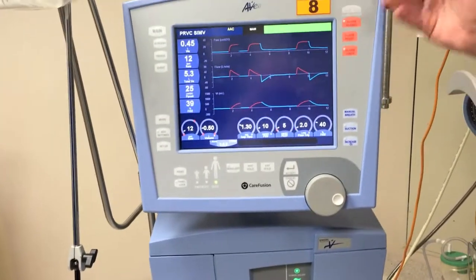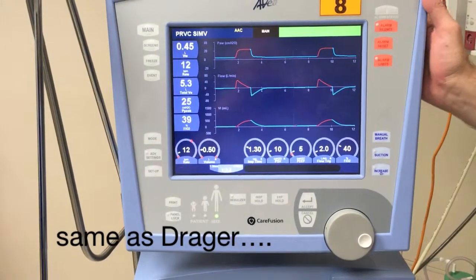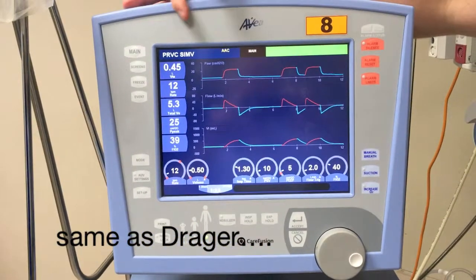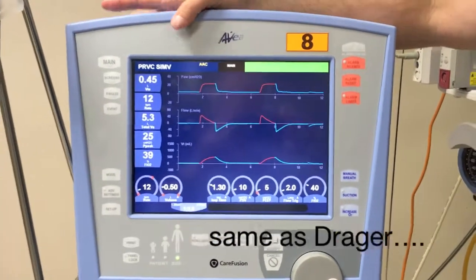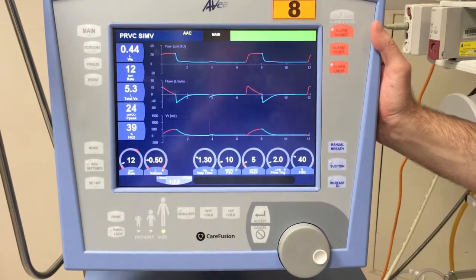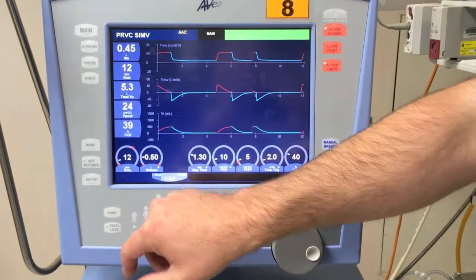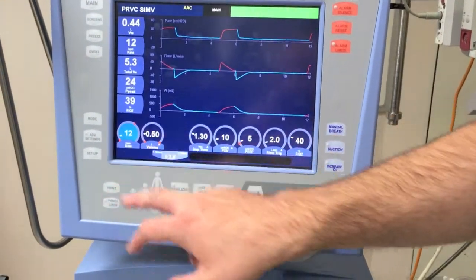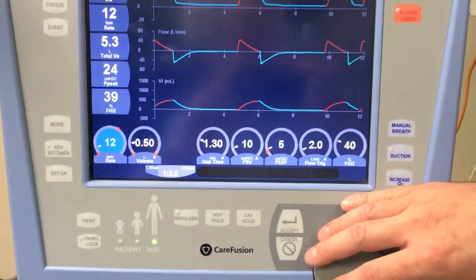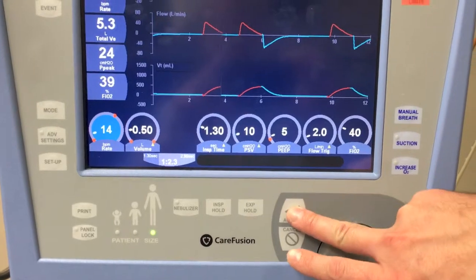With the interface, there's hard keys around the outside and soft keys internally. You can see at the moment we're currently ventilating in PRVC SIMV, which is a mode we commonly use instead of volume control on this ventilator. To change any of the settings, it's a touch screen — you can touch, and then use the dial to make adjustments, and then press the accept button.